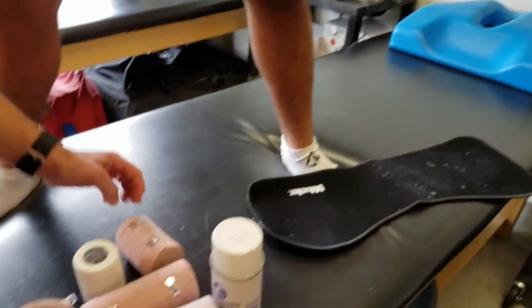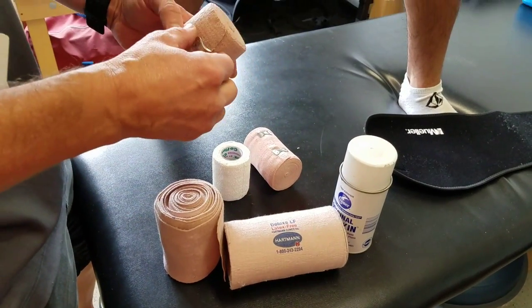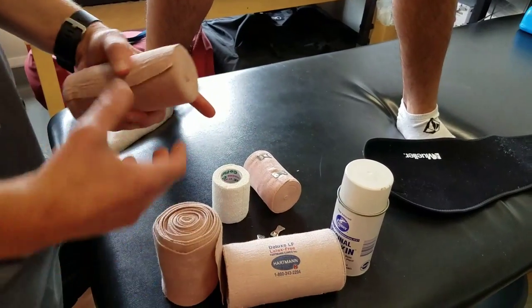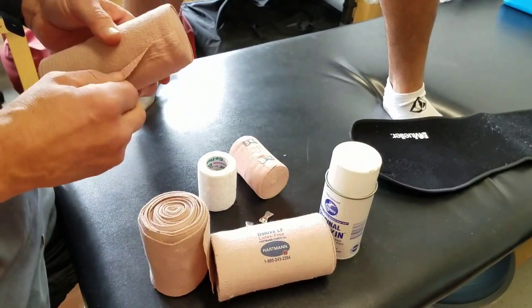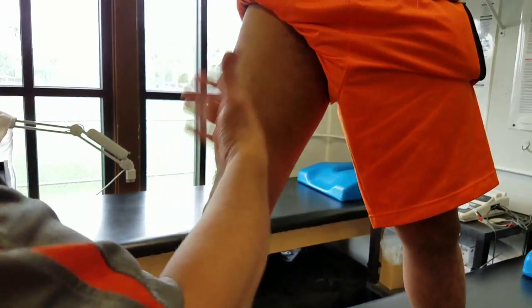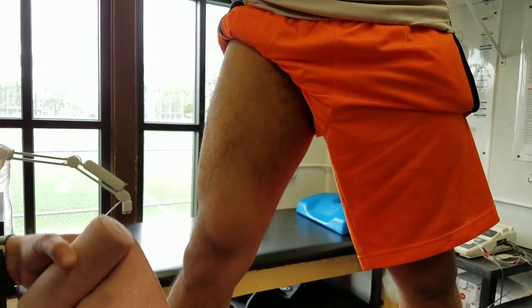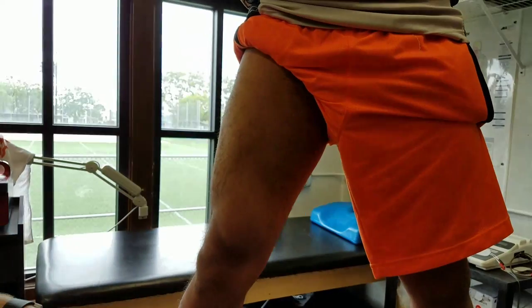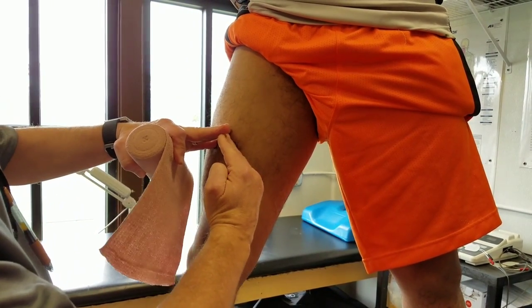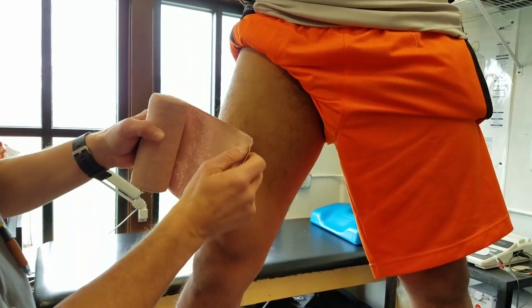So we go to the traditional ace wrap. I've got a six-inch regular — there are different brands and styles of ace wraps. First, we want to spray the leg to make it more tacky so the ace wrap will stick better. I use a diagonal, tiered application of the ace wrap.